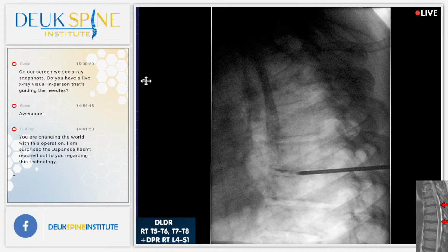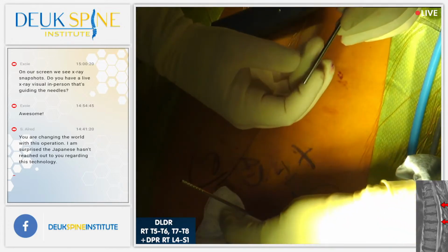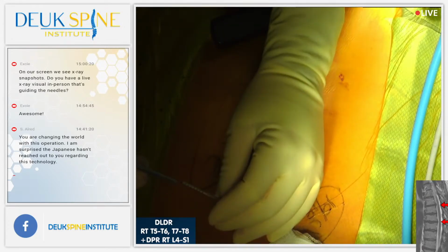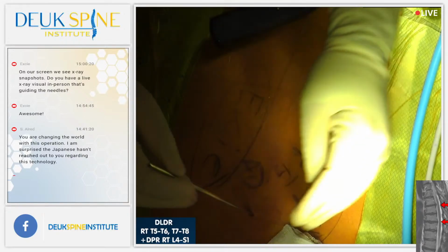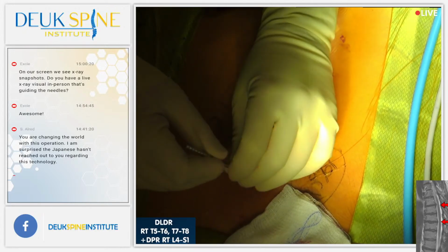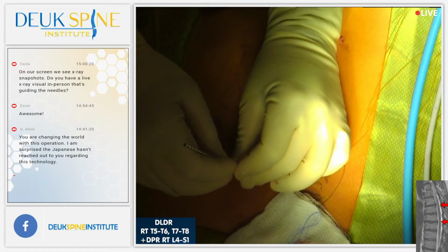And then we're going to bring the tube, the endoscopic tube. And for those of you who are interested, the entire surgery at this disc is going to be done through this tube. Okay? So it's 4 millimeters wide, which is why the incision is only 4 millimeters. You don't need the incision to be any bigger than the retractor or the instrument used to create the channel to do the surgery. She doing all right?